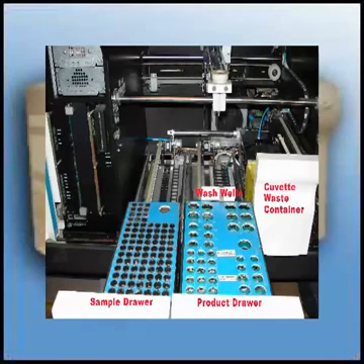Below the plexiglass cover there are two drawers. The one on the right is the product drawer and is used for reagents, quality control, and calcium chloride. The one on the left is used for samples and Owren-Koller buffer.